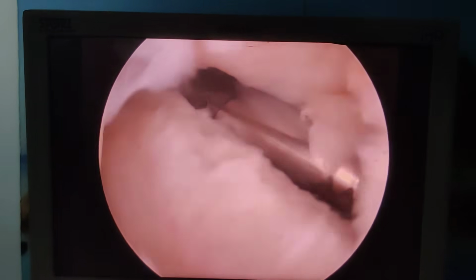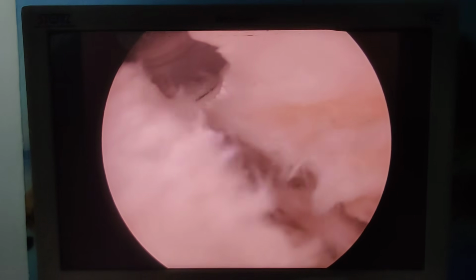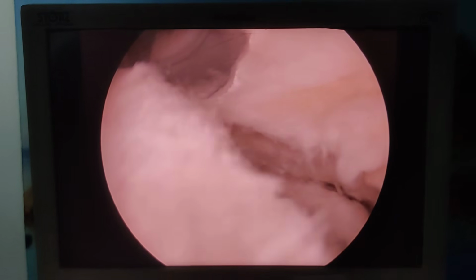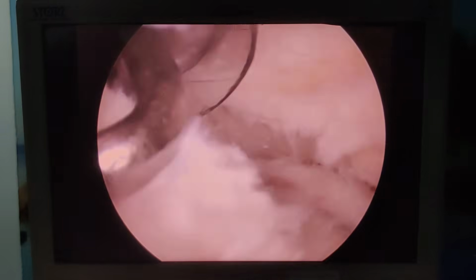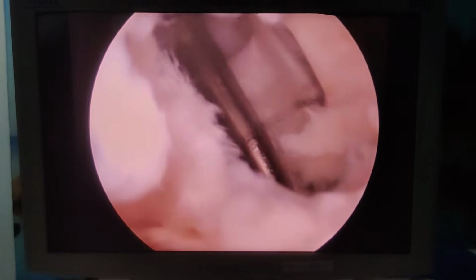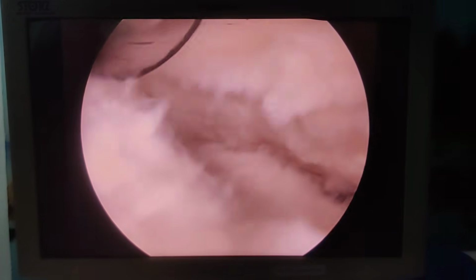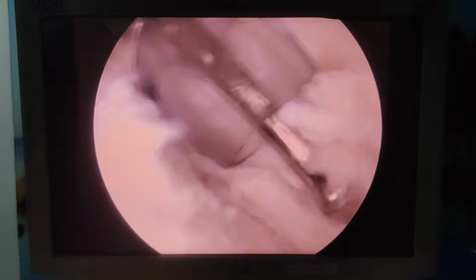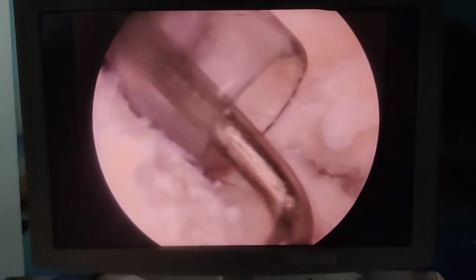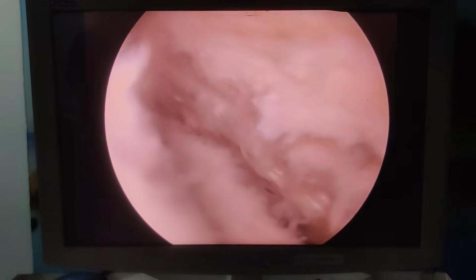But now you can see that I am slowly working my way down, and if I can stop shaving, can I just have my probe please? So if you can see here, I am starting to look down. So this is the end of the tibia, and I am trying to look down. So I am trying to clear all of this down. So I think I need to go a little bit more down. So let me continue my hard work, and once I have done it, but I think you guys have got an idea.